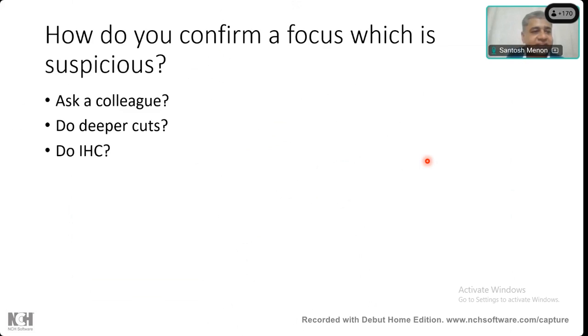So how do you confirm a focus which is suspicious? Snehil? What will you do? You will ask a colleague. Will you do deeper cuts? Do you do IHCs? IHCs. Deeper cuts?